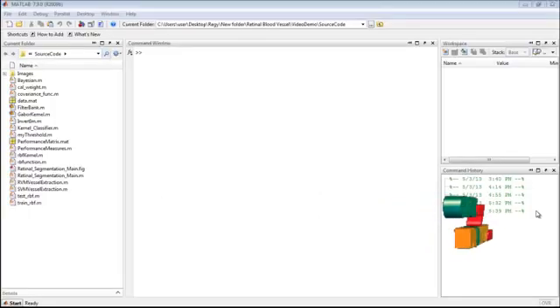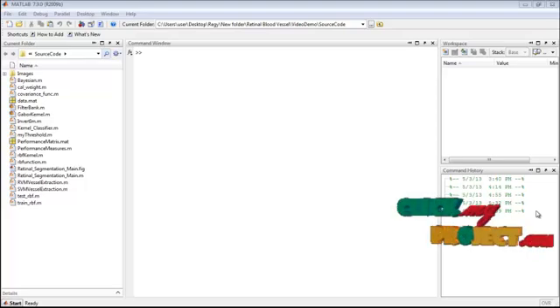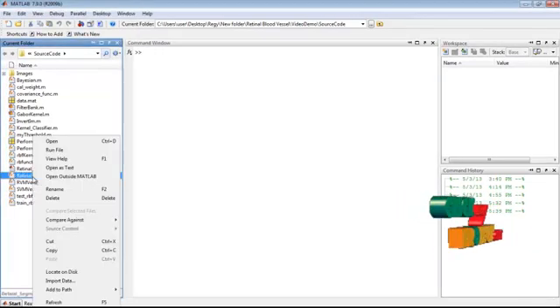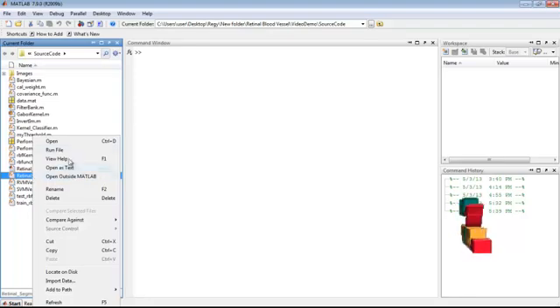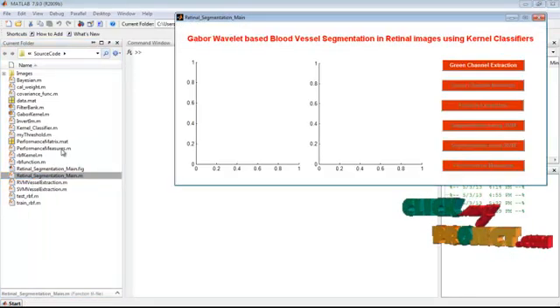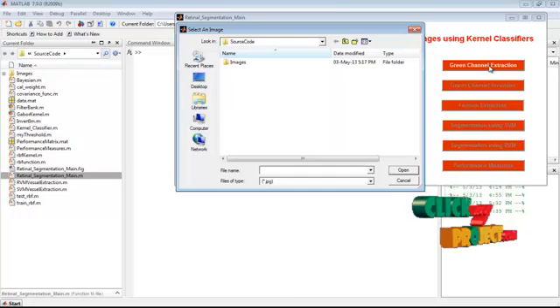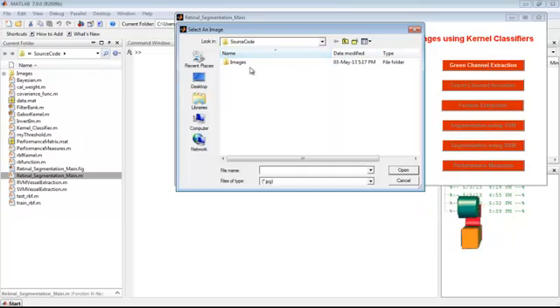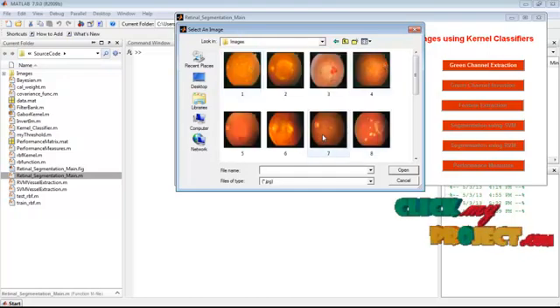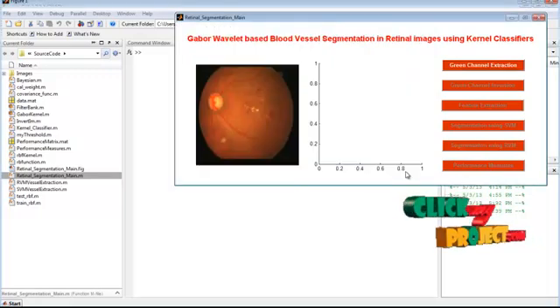Now we will see the demo of this project. Right-click on the 'retinal_segmentation_main.m' file and select 'Run File.' Click on the green channel extraction button, then select any image from the images folder and click the Open button.